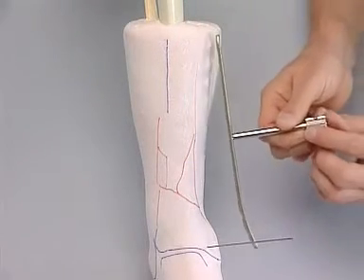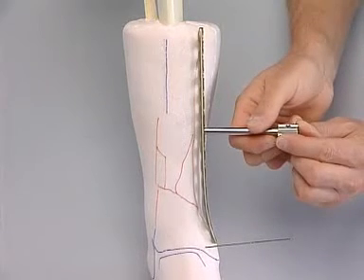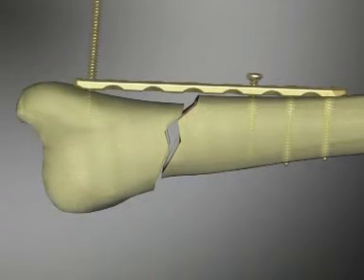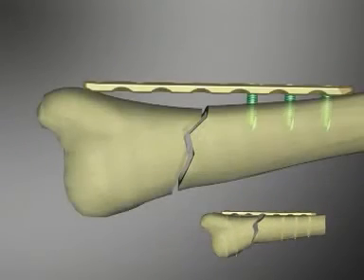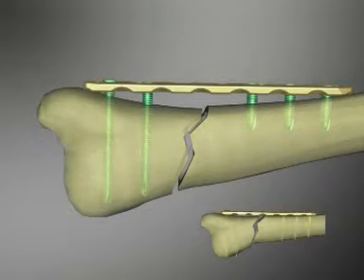In accordance with the fracture planning, the distal section of the LCP must be slightly bent and torqued. With the conventional method using standard screws, inaccurate bending of the plate inevitably leads to loss of primary reduction because the bone is drawn to the plate. This disadvantage does not arise if an LCP with locking head screws is used. Therefore, this plate does not have to be pre-shaped absolutely anatomically.